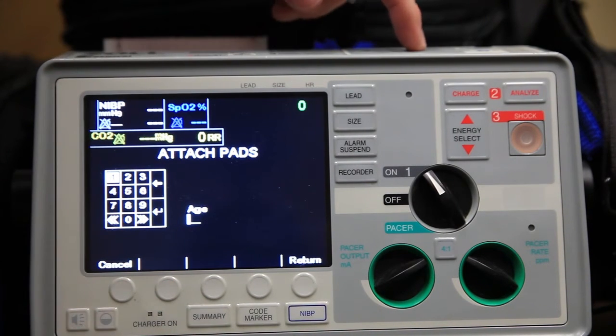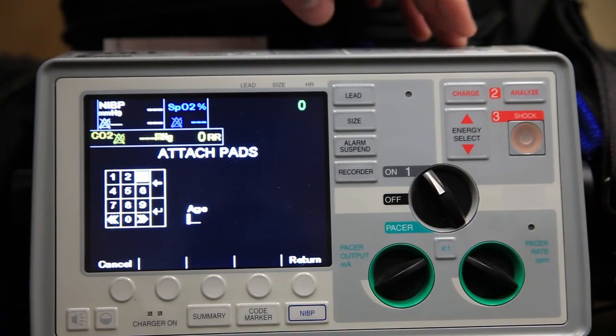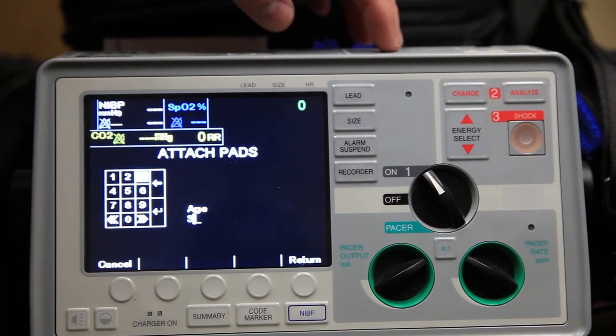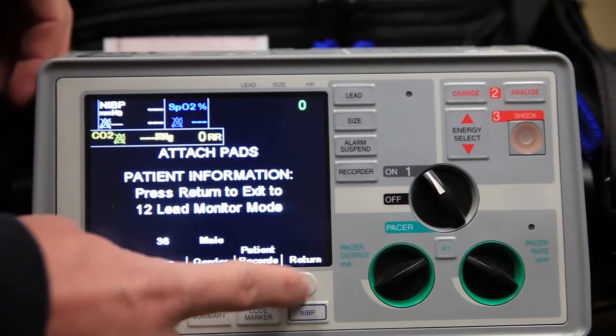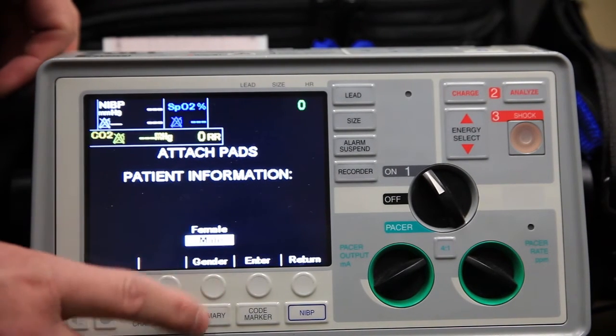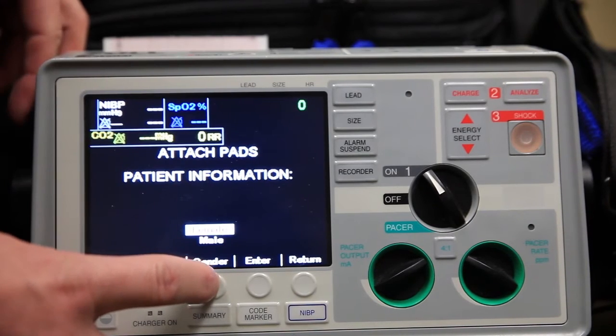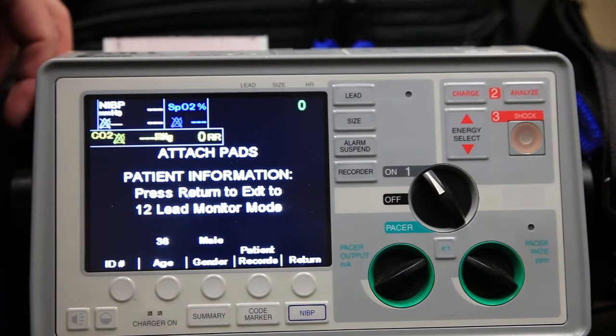Press the age, go up to the navigational keys on top, and arrow through to that person's age. There's a round button on top which is your enter key. Return back — it's now changed to 38 years old. The gender you can scroll through male or female. And now it's set up for a 38-year-old male.